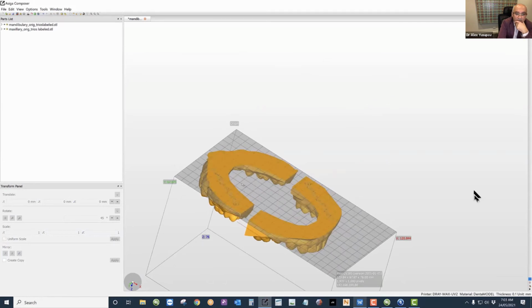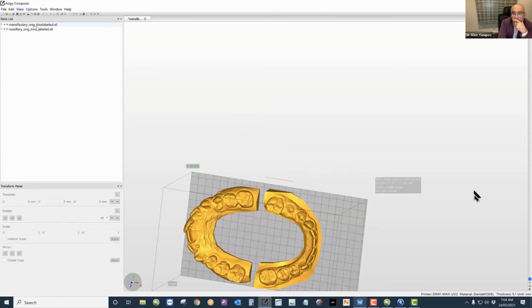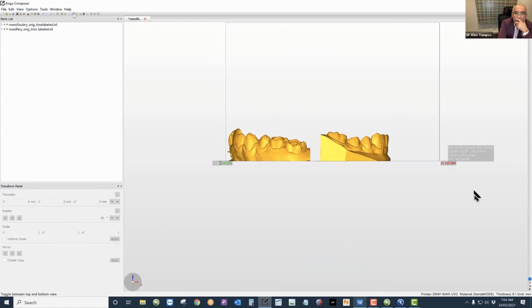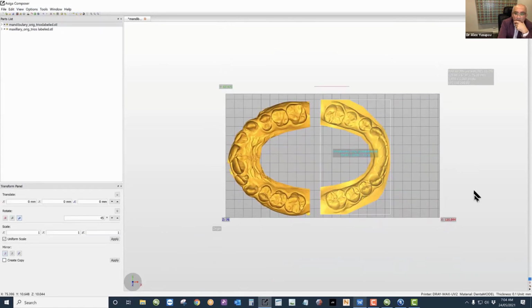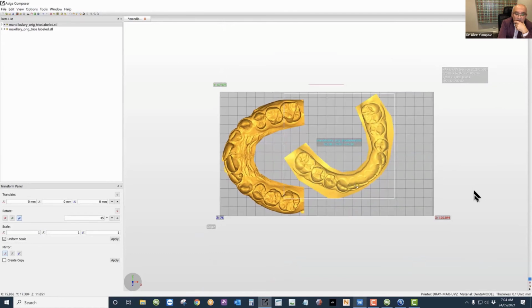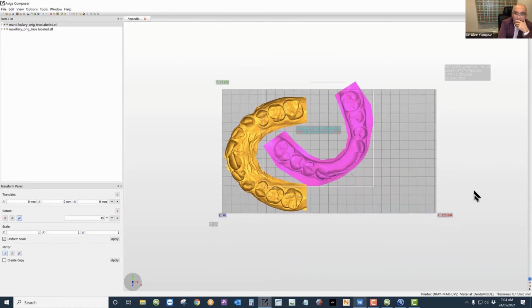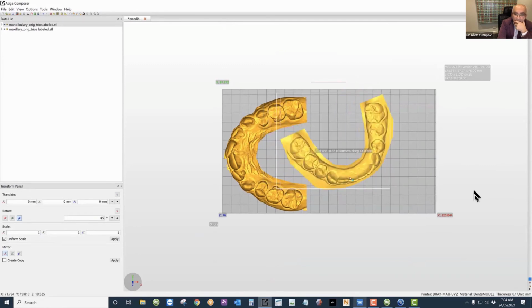If I was printing another model, let me just view and then just zoom to all. If I was going to print more than one model, or more than two models, I would probably rotate this model and try and get this into a slightly tighter configuration. So then I could probably print another model. The auto place, well, it's pretty good.